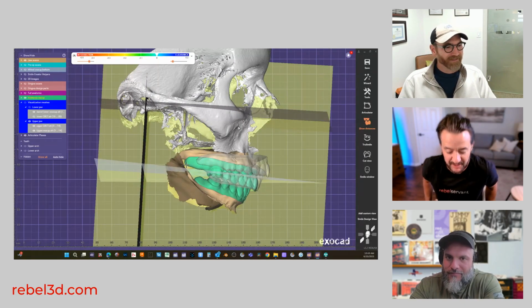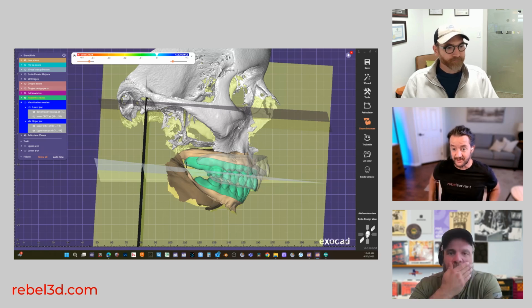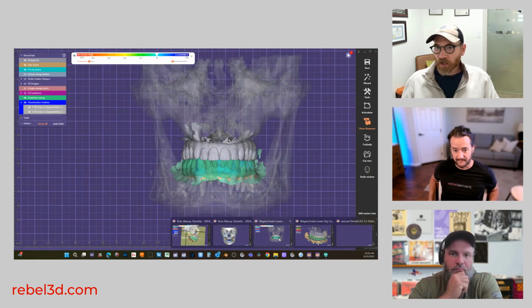Well, as we wrap it up, Dr. Sven, do you have access to a really complex case that you treated successfully, where when you mounted it, you were like, oh boy, this one's going to be challenging? Something you could show us, a difficult case that you solved with this type of mounting?